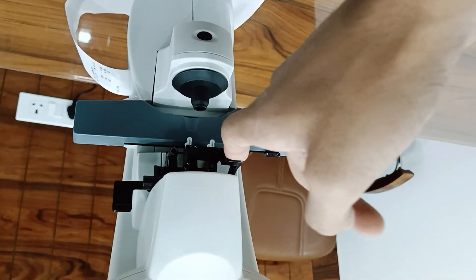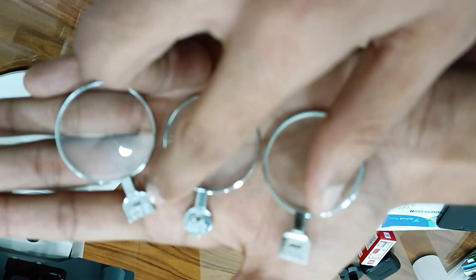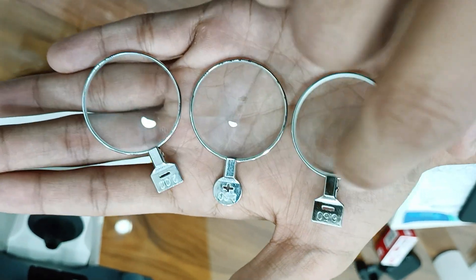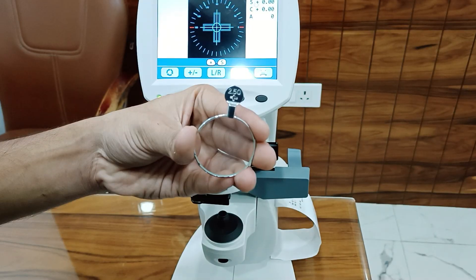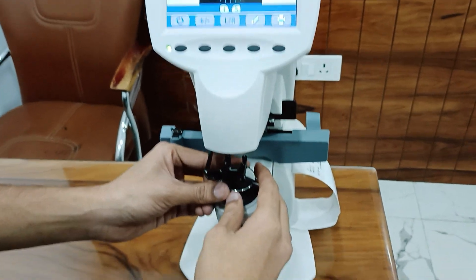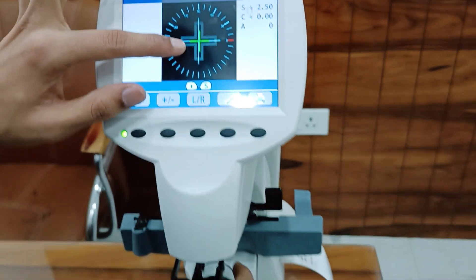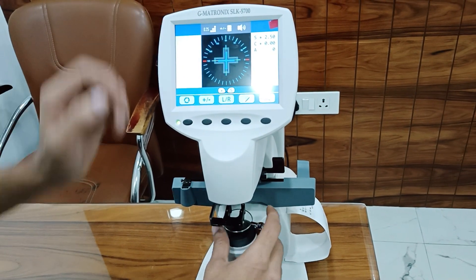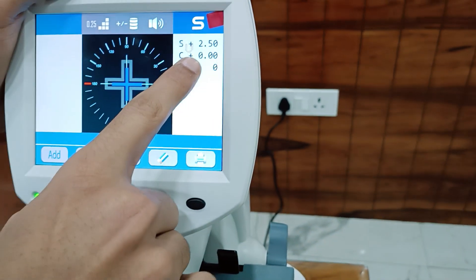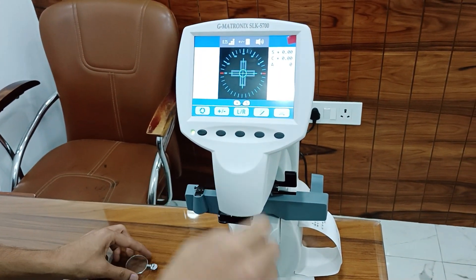I have three lenses: minus 2, plus 2.50, and minus 6.50. First I will take the plus 2.50. Press the handle to stop the lens from moving. The green light will automatically stop, and below the dark reading will be clear. You can check: plus 2.50. Erase — this is the cursor.